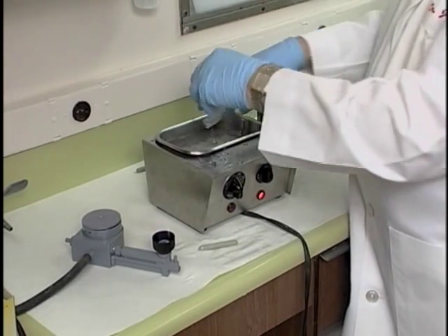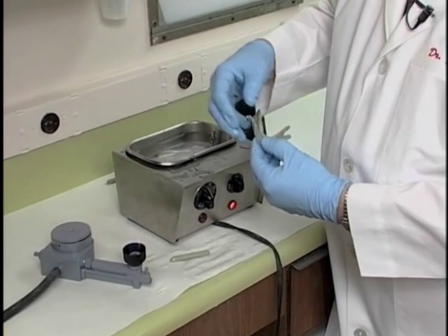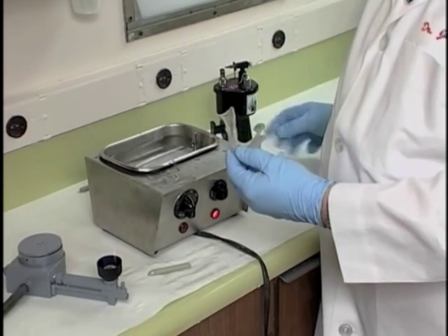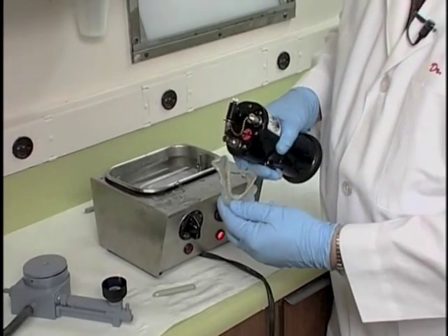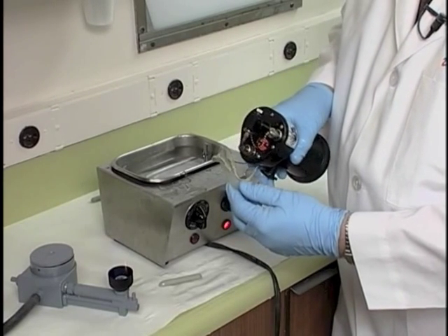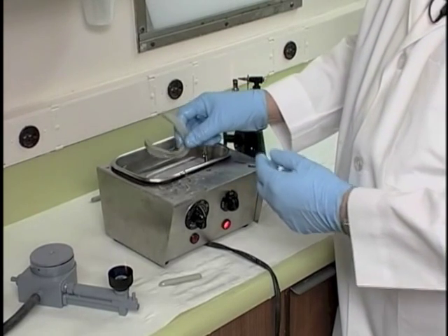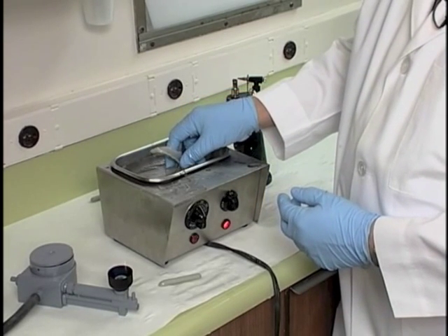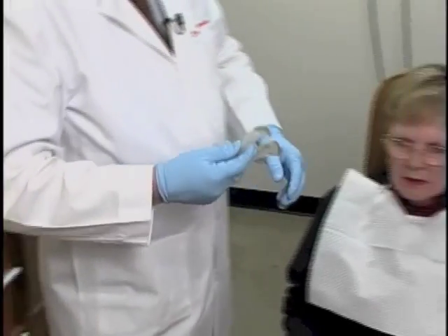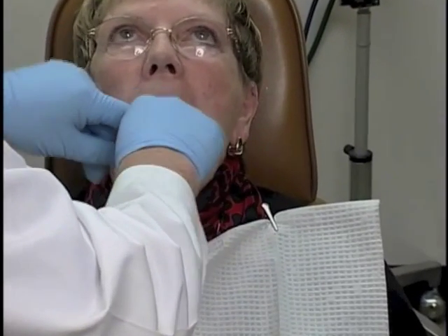Wet the material in the compound heater, mold it with your fingers, and then we take the torch and superheat it again to get it nice and soft, uniformly soft. We do a 3-second dip in the water bath, and now we're going to the patient's mouth. We rotate it into the mouth.